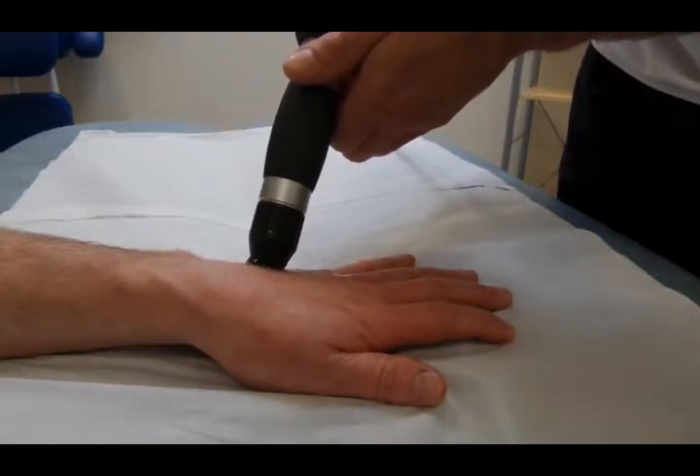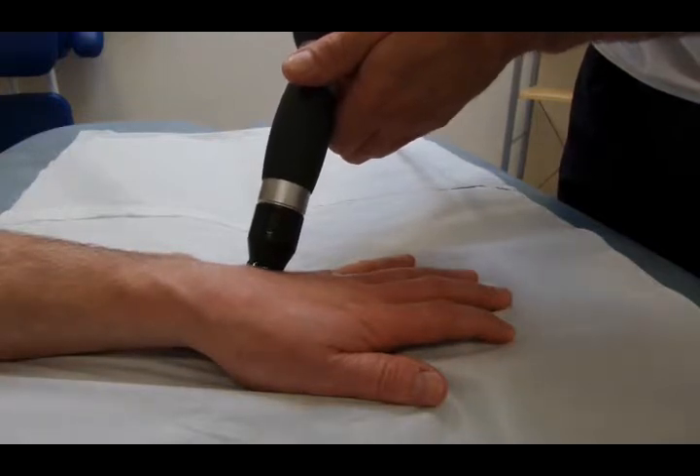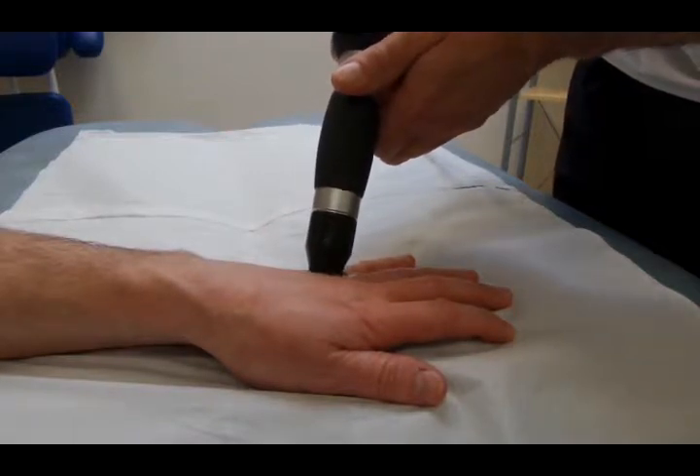We'll do as much as we dare. We come up to the area and just loiter on the area for a few shots. You can see the pain in the patient — you can actually see the hand twitching as we come onto that area, and you can probably see the patient gesturing. So that's the painful area, then down at the bottom.